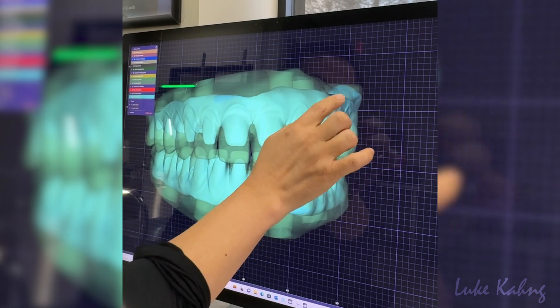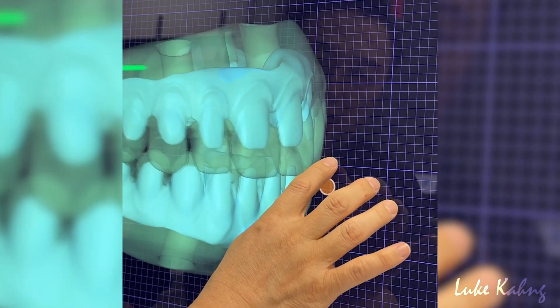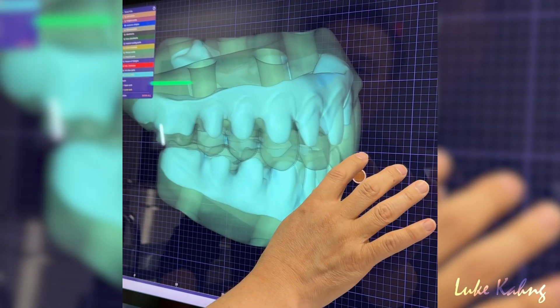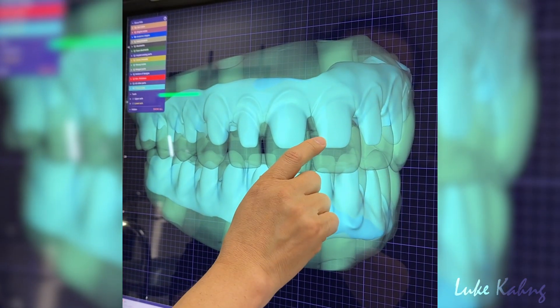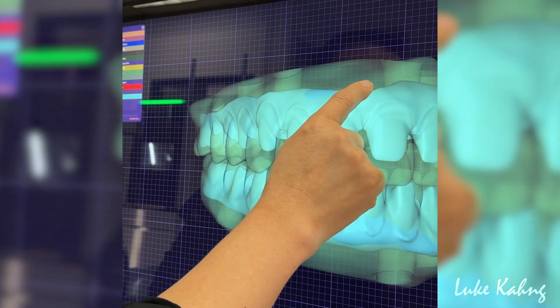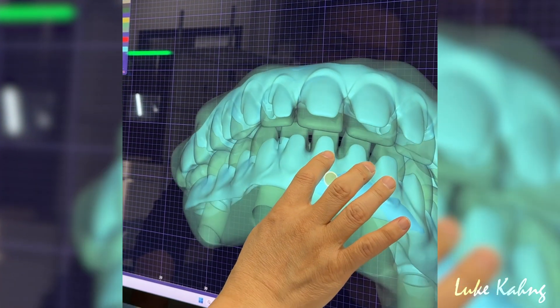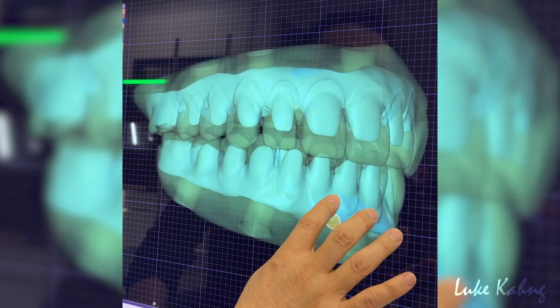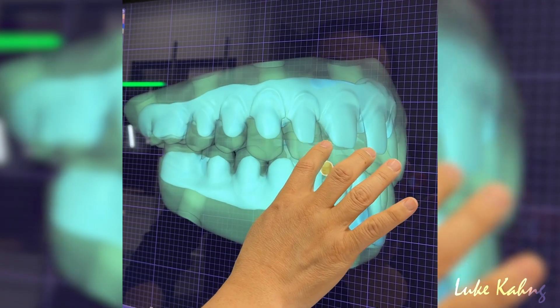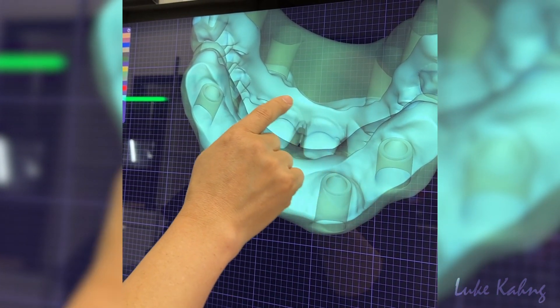I have to grind more here. I wish I could get more strength, and then try to cover. I have to cut it more here.